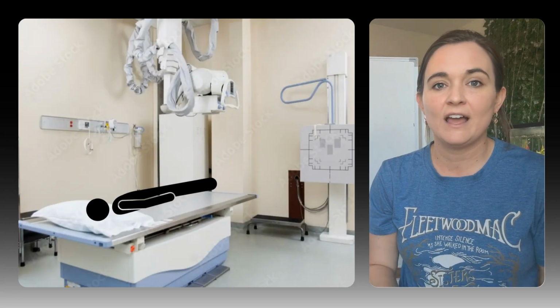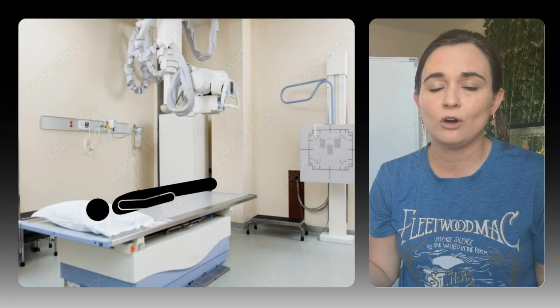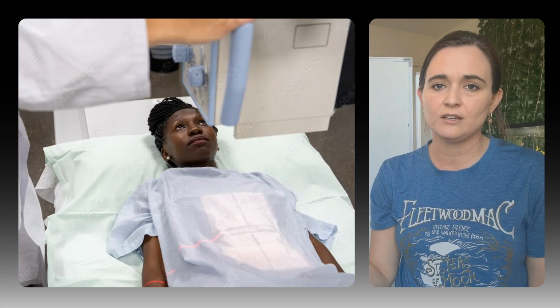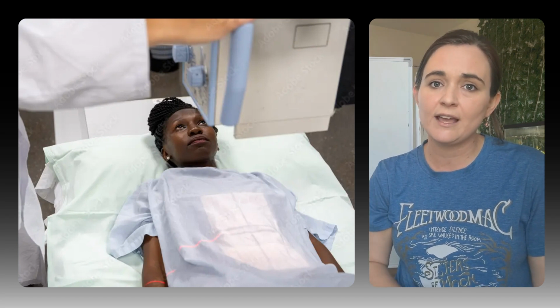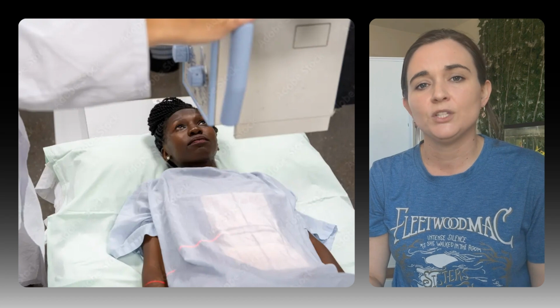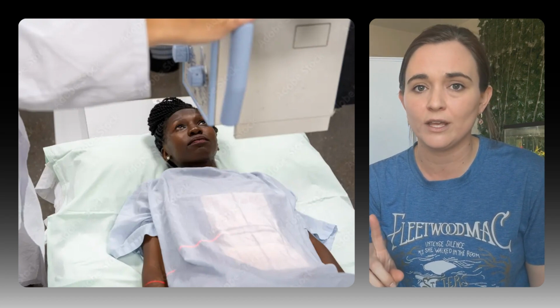All right, back to Mrs. Garcia. We're going to have her lying on the table, and we'll start with the AP supine, also called a KUB. Let's talk through this step by step. You position her flat on her back, arms at her sides, legs straight. Central ray goes to the iliac crest, which for most patients lines up with the belly button. You say, take a deep breath in, and now breathe out, and hold it.